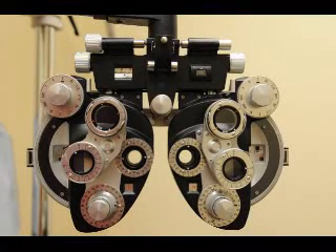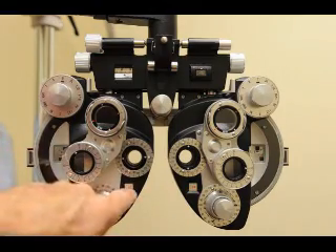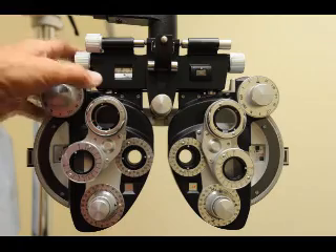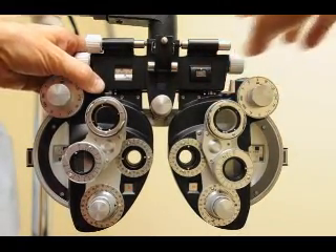This is Dudley Harris speaking and we're going to review refraction with the phoropter. The first thing to do is zero out the phoropter — zero the sphere, zero the cylinder, same thing on the other side. Make sure that the levers are set in the out position because you're testing for distance.